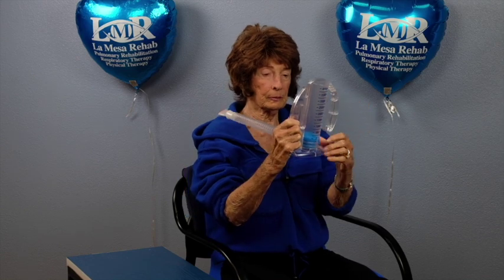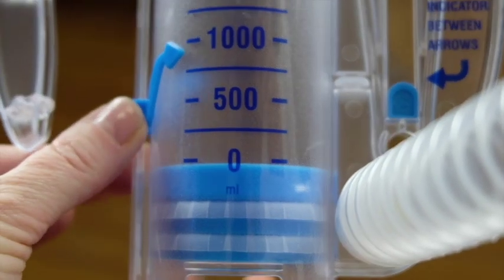Then remove the mouthpiece from your mouth and breathe out. Repeat this 10-20 times, and try to rise that marker right up to 1000.